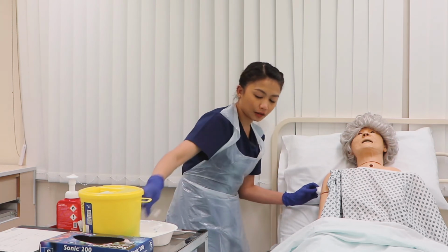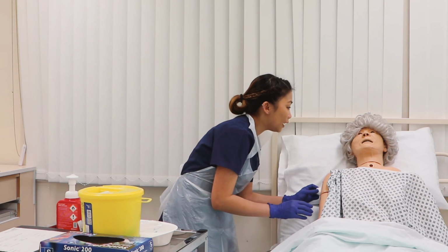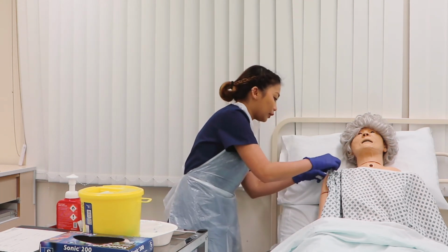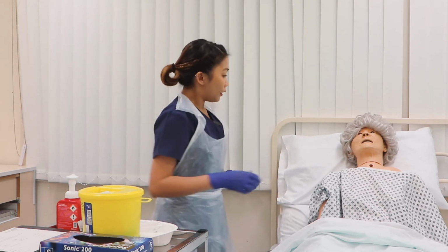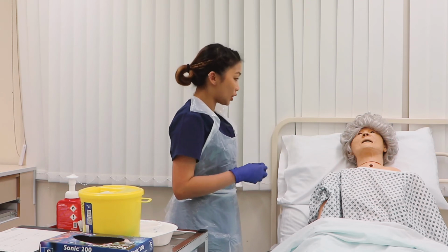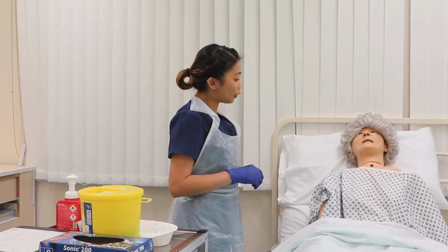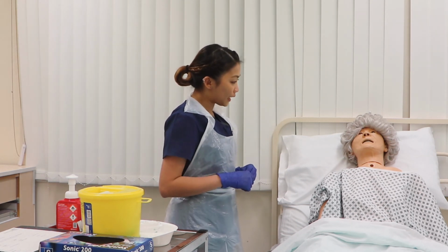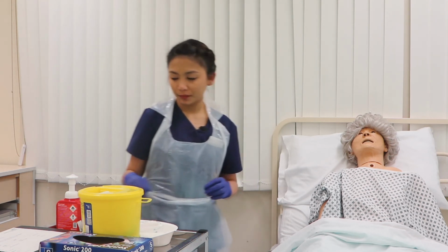Activate the safety lock. Alright. Are you comfortable, Andrea? There's no bleeding. Okay. Can I roll down your sleeves? So, Andrea, I've given you your insulin via subcutaneous injection. If you need anything, just let me know. I'll be just in the other room to do my documentation and aftercare. If you need anything, just give me a shout. Alright? Thank you.